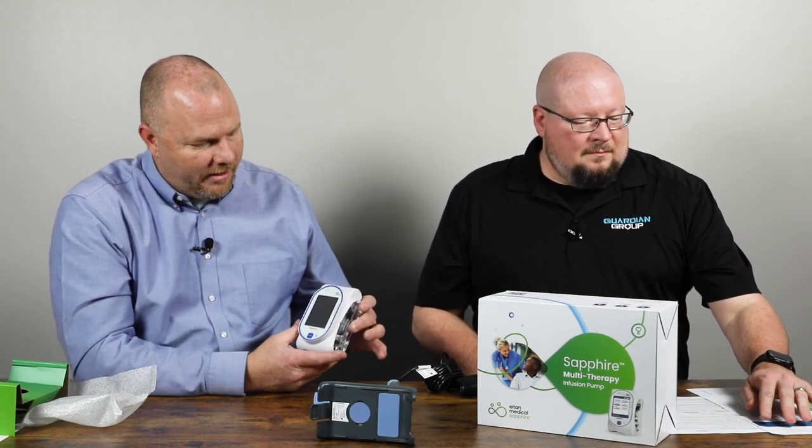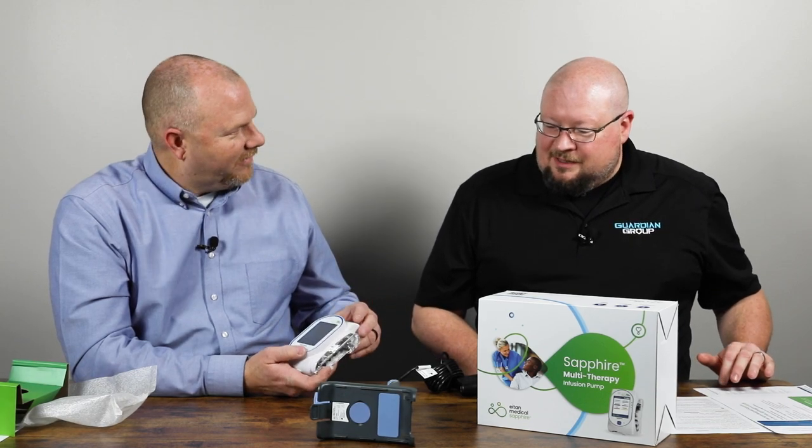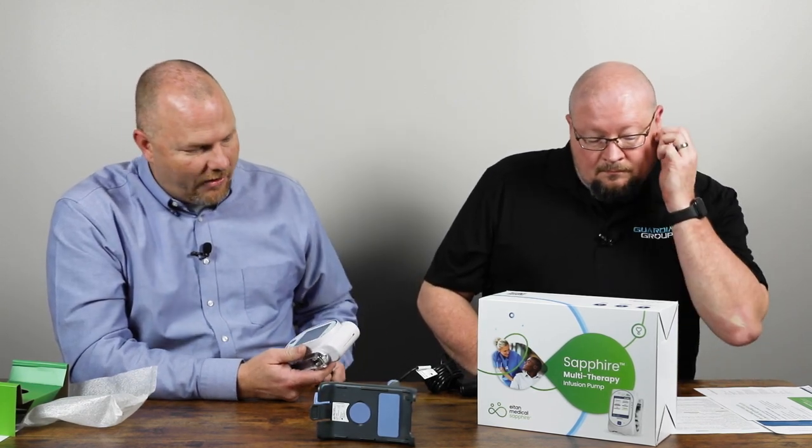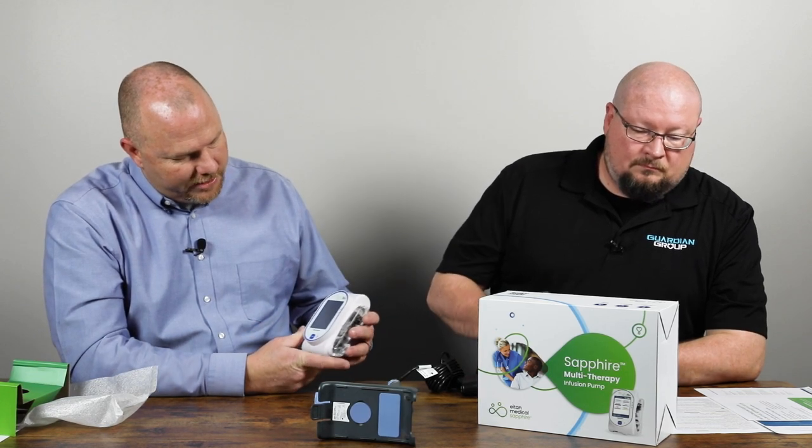The pump itself is a touch screen — the screen is pressure sensitive, not heat sensitive. It's not like our cell phones where it's feeling the heat from our fingers; it's actually a pressure screen. That's really useful in the EMS field when you're operating in the rain with gloves on, or dealing with humidity, blood, or hand sanitizer. You can literally cover the face of this with water and still demonstrate how easy it is to operate even when the screen is wet.